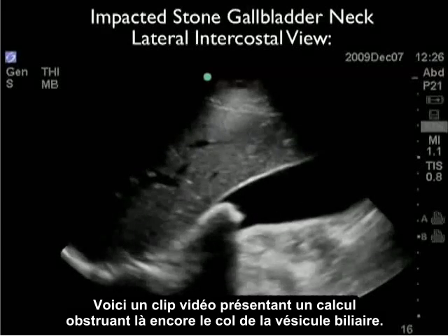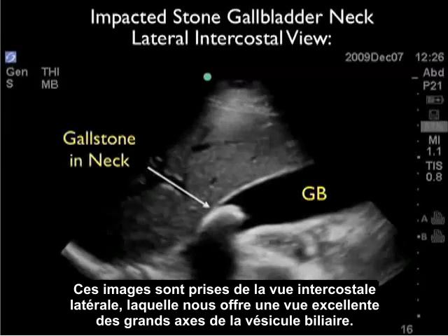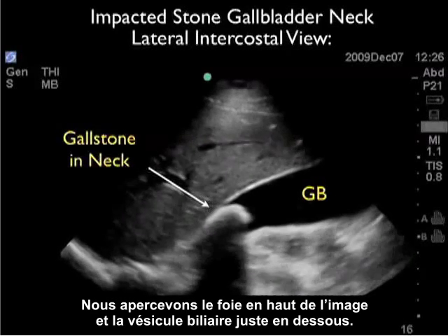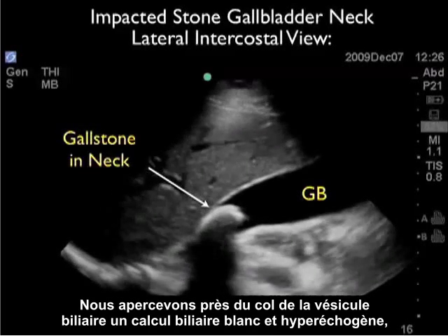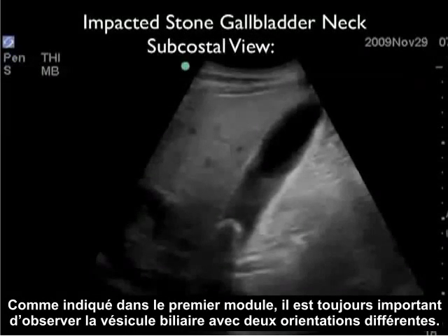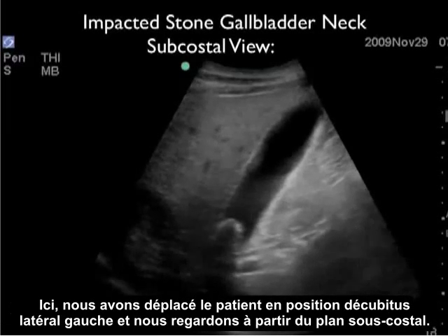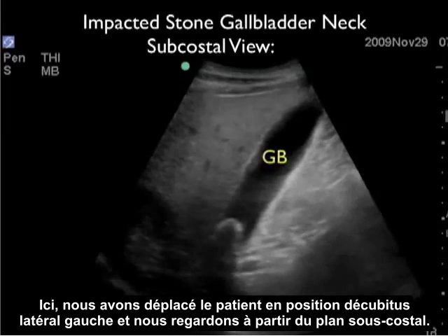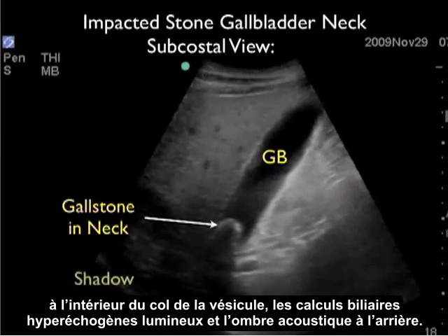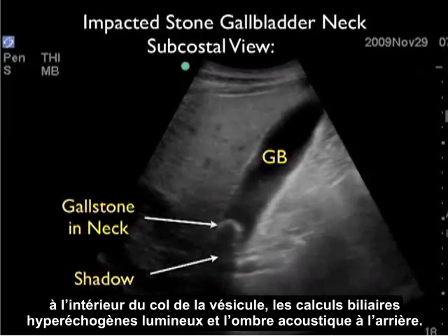Here's a video clip showing an impacted stone at the gallbladder neck, again from that lateral intercostal view that gives great long axis views of the gallbladder. We see the liver at the top of the image and the gallbladder inferior to the liver. Towards the neck of the gallbladder we see a white hyperechoic gallstone with classic posterior acoustic shadowing. As mentioned in module one, it's always important to look at the gallbladder in two orientations. Here we've moved the patient into the left lateral decubitus position scanning from the subcostal plane, and again we see the hyperechoic gallstone within the neck with posterior acoustic shadow.